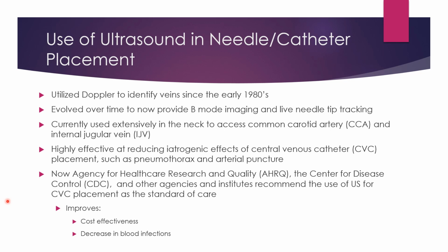So it really helped drive the beginning of the possibilities that we're seeing come into fruition now. Over time, the technology improved. Our black and white, or our B mode, got a lot better, so we could see vessel walls more clearly. We could see deeper in the patient. We also had enough spatial resolution that we could track an actual needle tip.